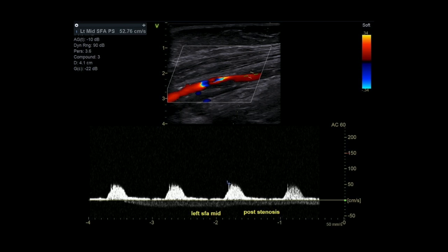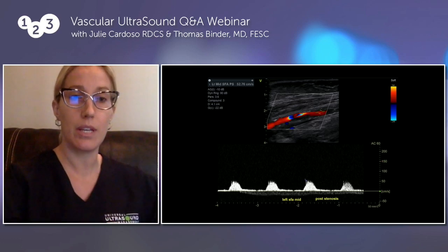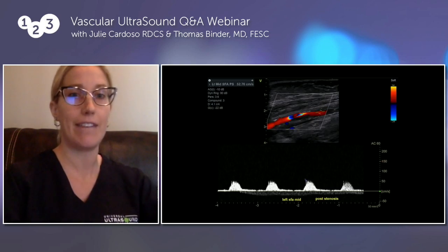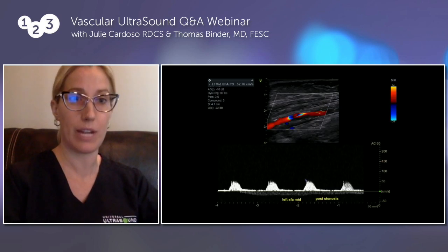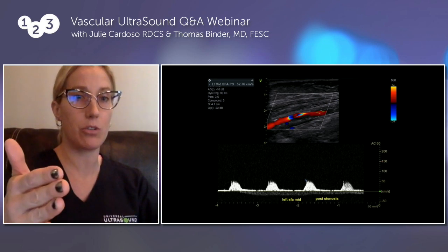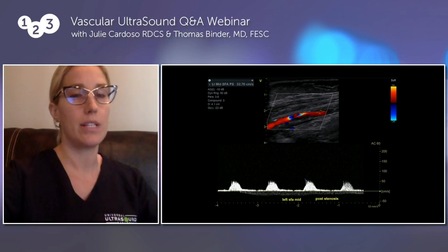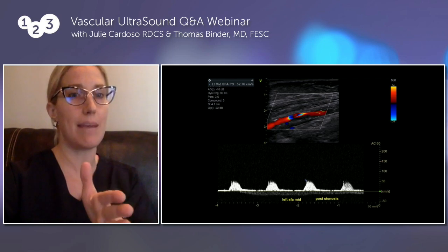And then we also want to see the effect of flow post-stenosis. As you can see in this spectral Doppler waveform, it's dampened and monophasic, which would be normal for this vessel because, again, there are two stenoses. So there's tandem stenosis: one proximal, in the superficial femoral artery, of greater than 70% that already had an effect on the blood flow hemodynamics. And then we had another stenosis of 50%. So of course, the post-stenotic flow to these two stenoses would be dampened and monophasic.